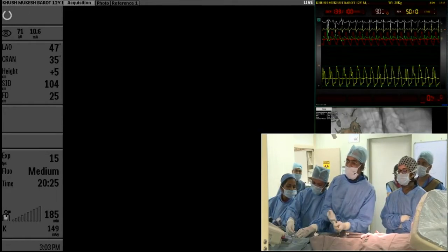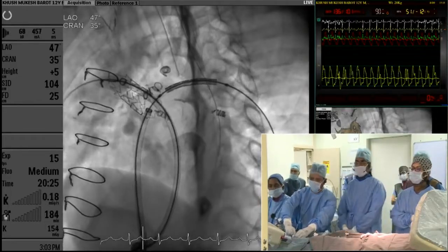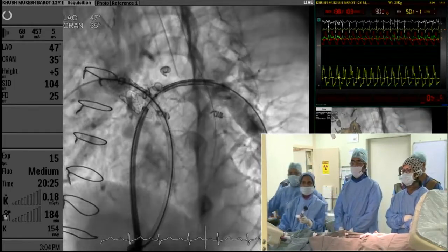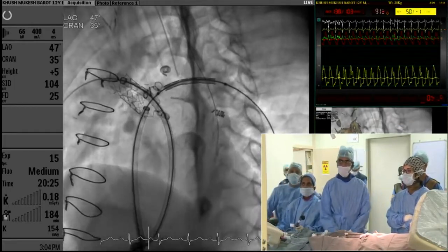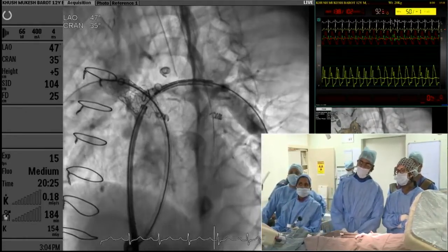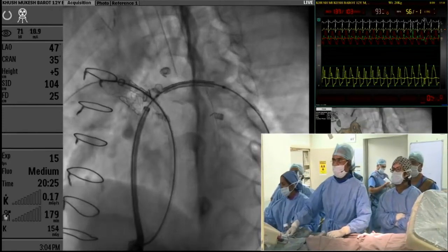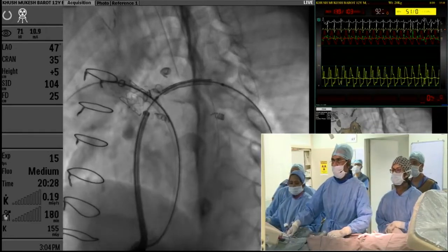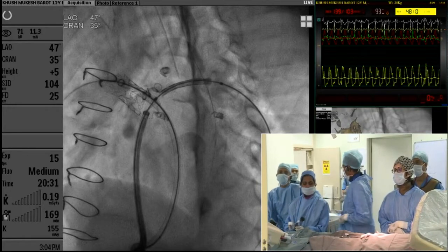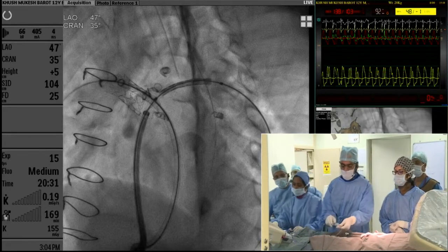Now I'm checking. Okay, so the two markers look fine for me. Do you like to come back a bit? Pull it back, yeah. I will get a little bit more into the main pulmonary artery. What do you say, Dr. Chetan, Dr. Bharat? Dr. Devashree wants it marginally pulled out, so I'll pull out a millimeter. But I think the metal clip is a clear indicator that I am covering the LPA origin. I'll make another angiogram.